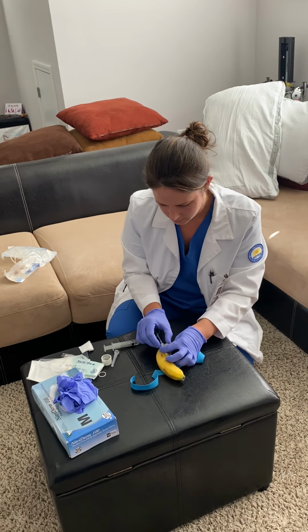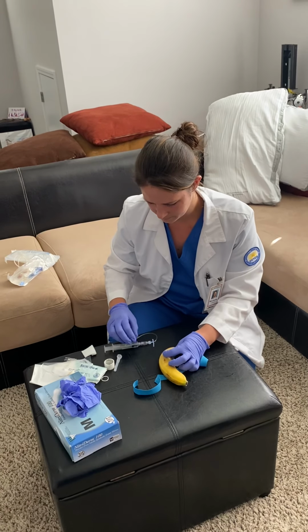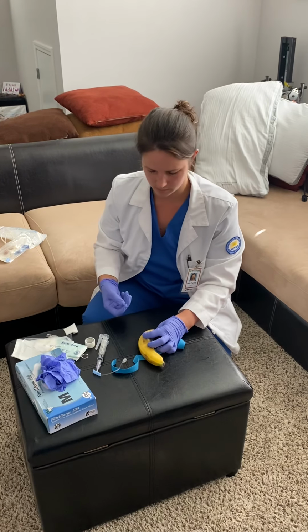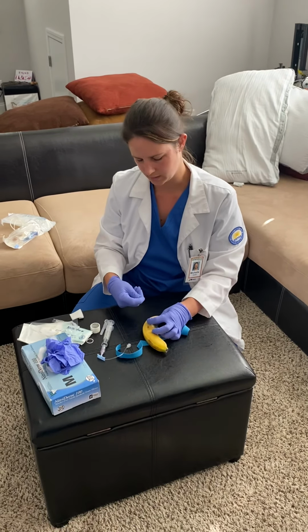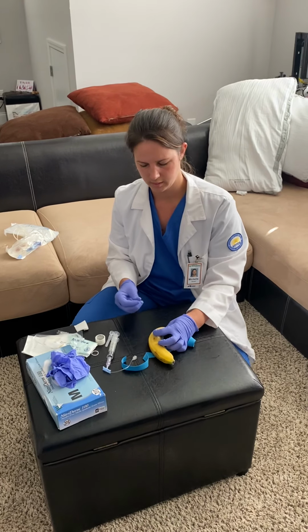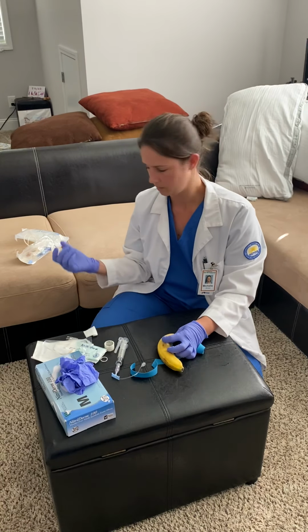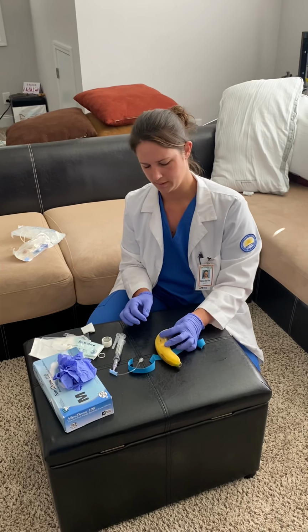I'm going to now attach my 2 milligrams of morphine push here. And I pretend I have the 2 milligrams that's already been drawn up. I would go ahead and push that medication, and then using sterile technique and making sure you're alcoholing the top, making sure that you're not cross-contaminating, and then I would place my IV line on top of it afterwards.